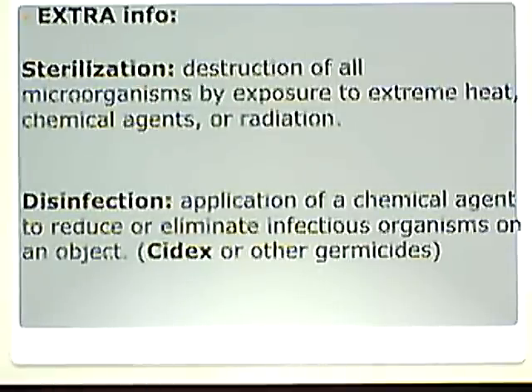Disinfection is the application of a chemical agent to reduce or eliminate infectious microorganisms on an object. Something called Cidex, or there are germicides that do this. It's a spray-on application. This is what Annette is doing to her countertops. She's not sterilizing them because she doesn't have a flamethrower and isn't heating up her granite countertops.